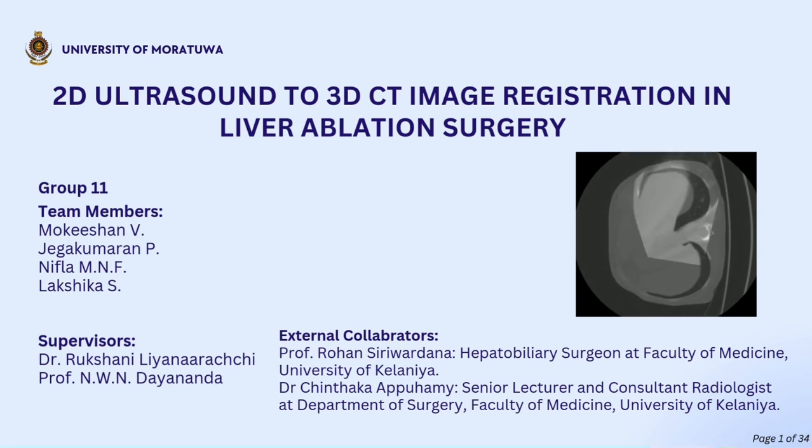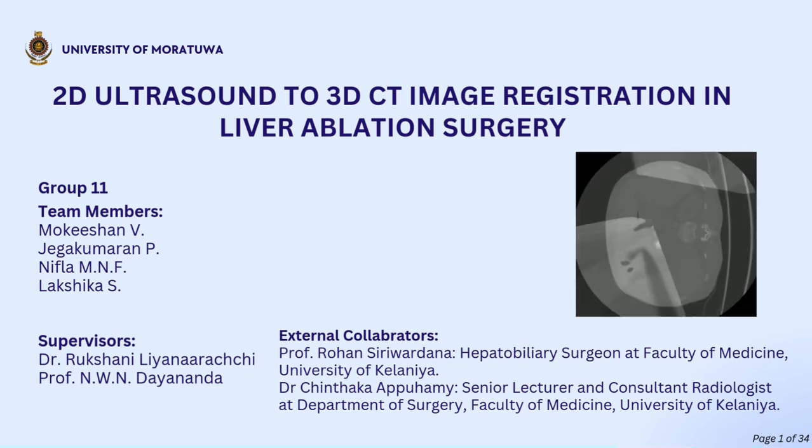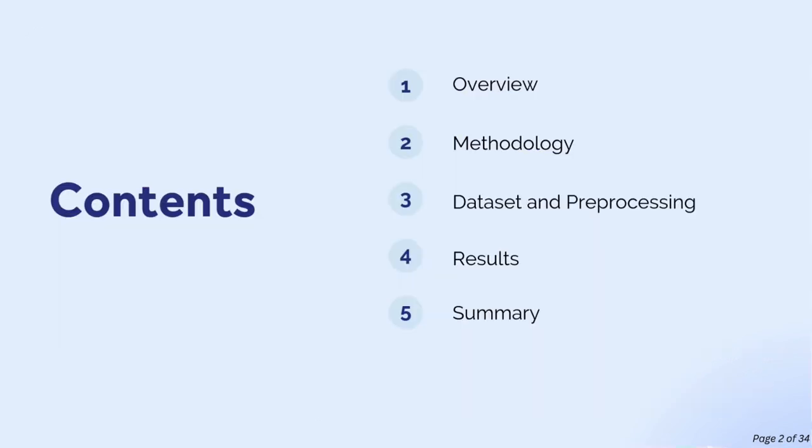Hello everyone. Today I am excited to present our work on 2D ultrasound to 3D CT image registration for liver ablation surgery. This research addresses a critical challenge in aligning 2D ultrasound frames with 3D CT volumes, ensuring precision during minimally invasive procedures.